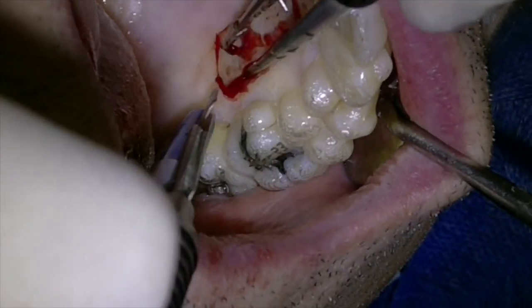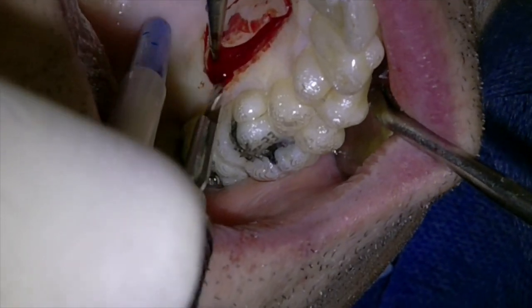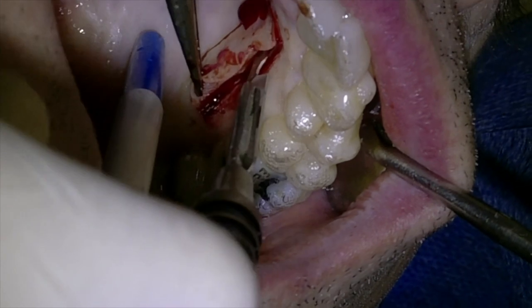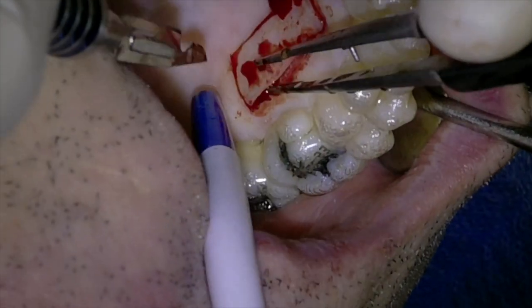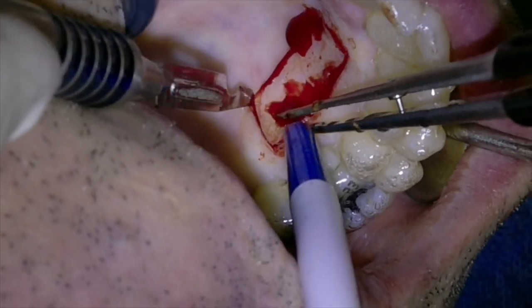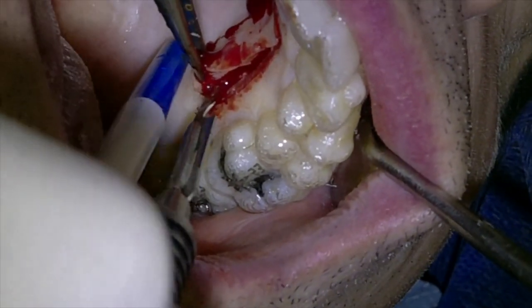Have in mind that today we're not reaching the bone, we're not scratching that area, we're just leaving connective tissue in touch with the periosteum, so we cover that area, we allow the healing to be faster, and at the same time, we minimize the inflammation and complications for the patient.